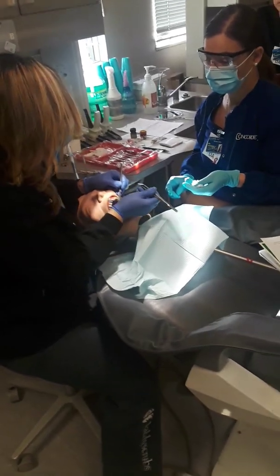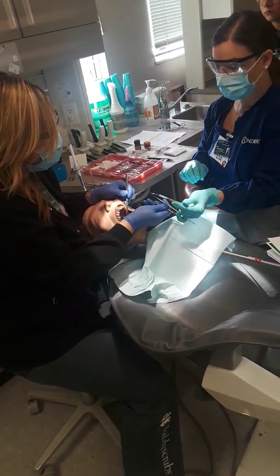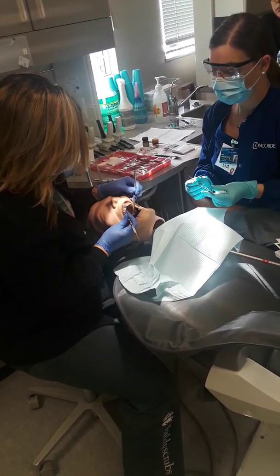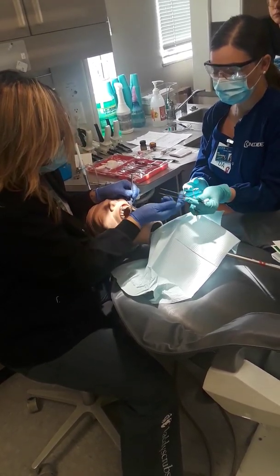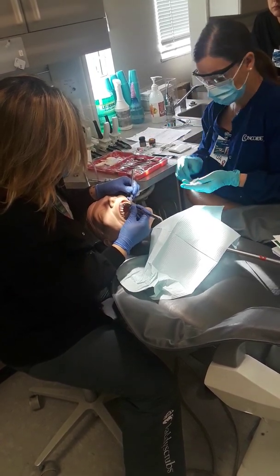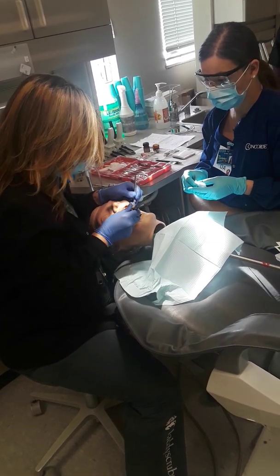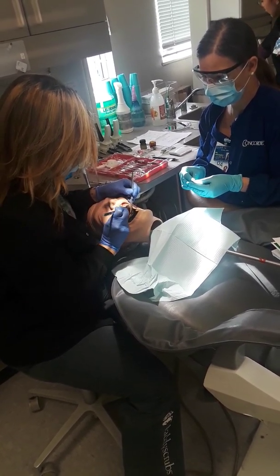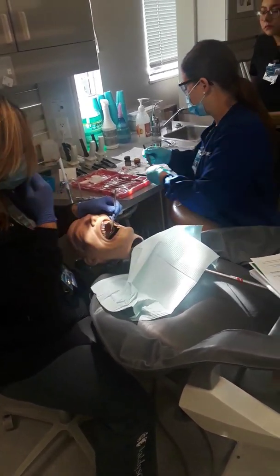And I get an Explorer because I can't get it out. So I'm deviating from your checkoff sheet. I packed the cord really well and I couldn't see the feet, so I had to use an Explorer to pull it, and these cotton pliers. Okay, slowly in a circular motion and it's out.